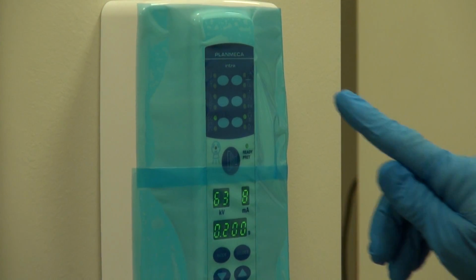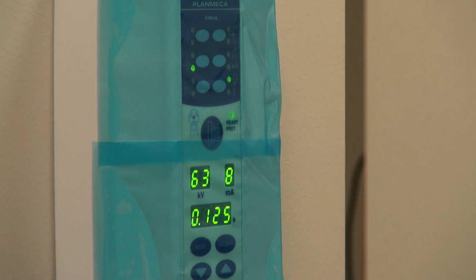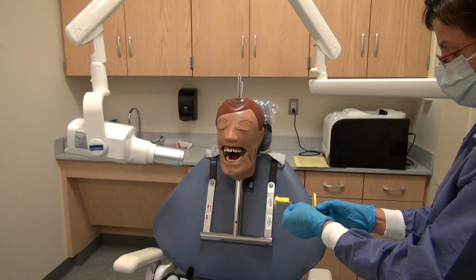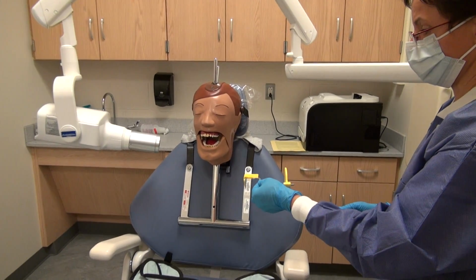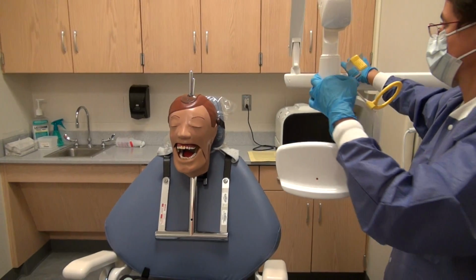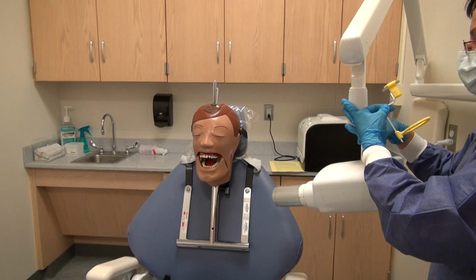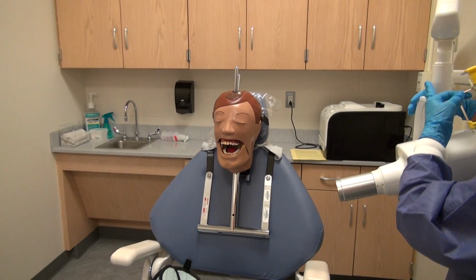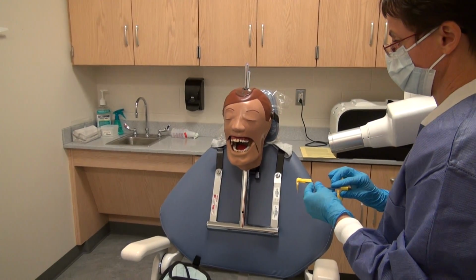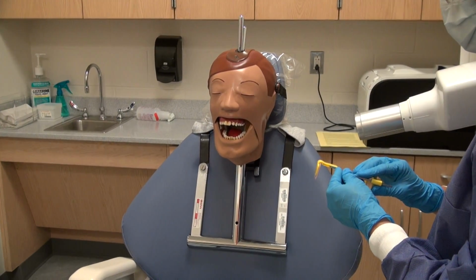Recalibrate at the control panel, illuminating the mandibular premolar periapical icon. Pull the ring away from the film slightly for placement. We'll need to move the tube head over to the patient's left side and separate the extension arms prior to placing the XCP in the patient's mouth. Please notice that the patient is at a height that is very easy to work with. Adjusting the patient chair to the right height is very important to decrease the chances of operator ergonomic related injuries.